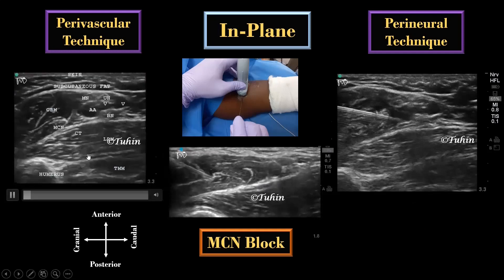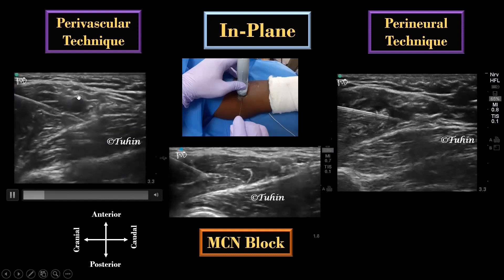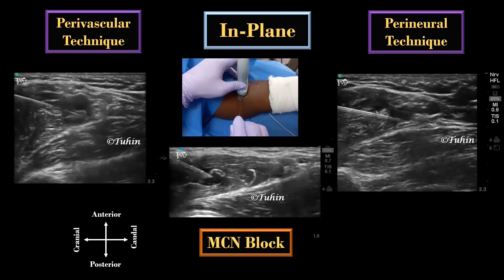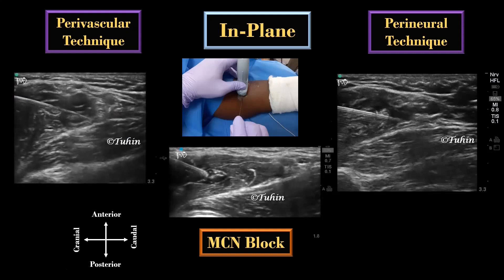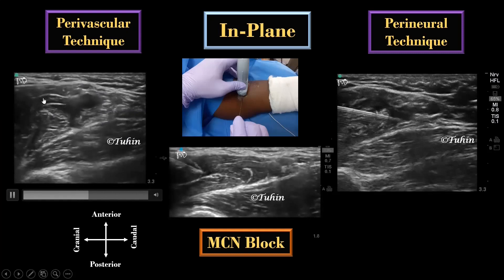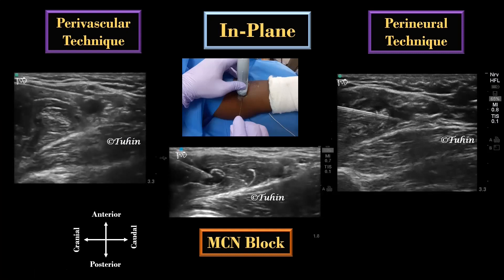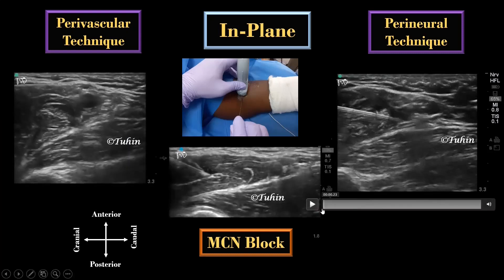In the perivascular approach, a single injection is performed at the 6 o'clock position, or double injections at 6 and 12 o'clock to the artery are performed. Local anesthetic is deposited posterior to the artery first to avoid displacing our structure of interest deeper. The 12 o'clock position can be accessed from either side. Here, we are not targeting any individual nerves, just depositing local anesthetic anterior and posterior to the axillary artery.